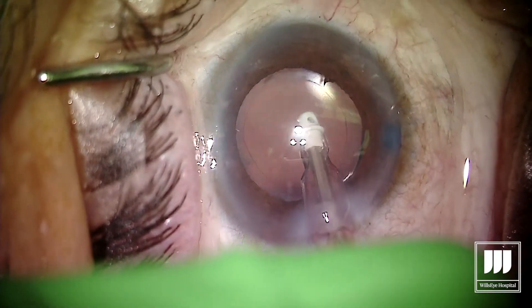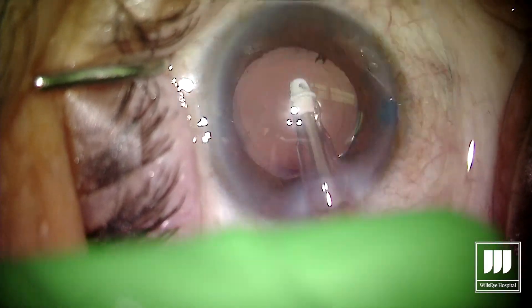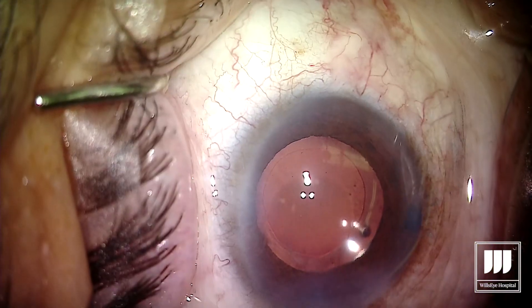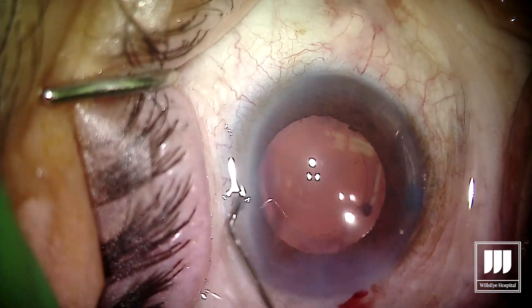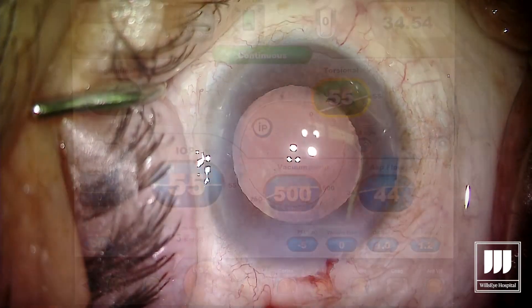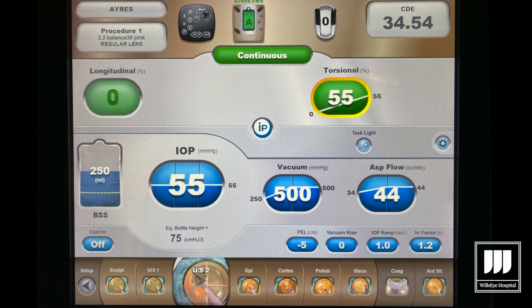Cortical cleanup is pretty much a snap with MyLube as well, even with mature lenses. All that's left now is to seal up the wounds. With our use of MyLube we've been able to increase our efficiency in the OR and decrease our energy use — as you can see here, we were able to remove this mature lens with a CDE under 35. Thanks so much for watching.